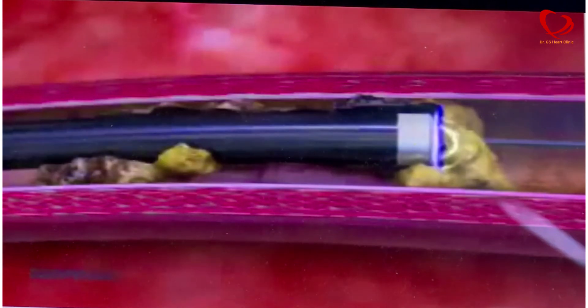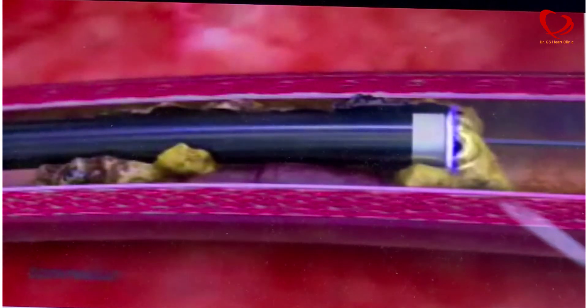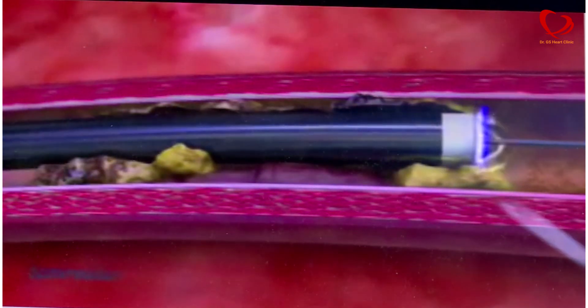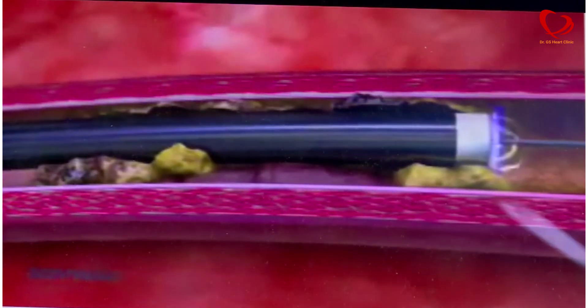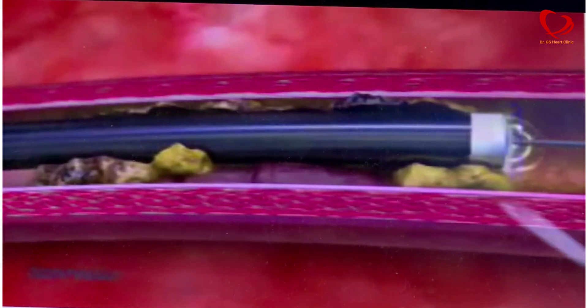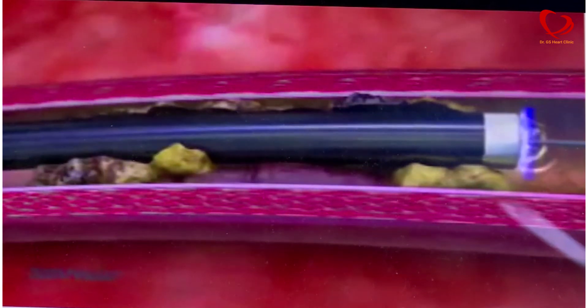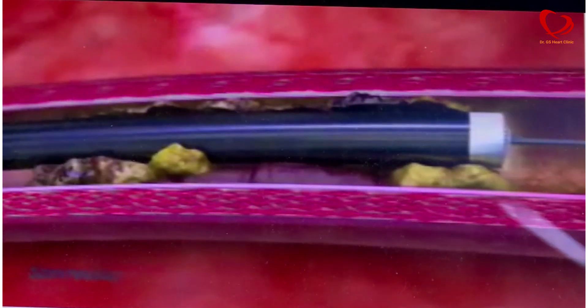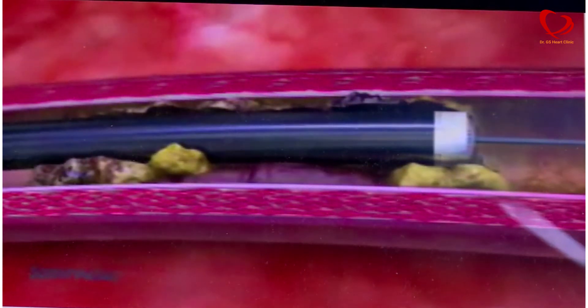Thereby a big lumen is created — the artery blocks are cleared and we are able to pass the stent and the balloon to create good flow to the vessel. This is particularly effective when conventional methods of balloon fail; laser is very useful in treating such complex lesions.